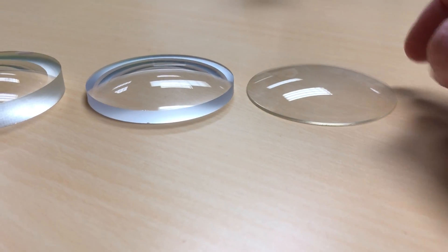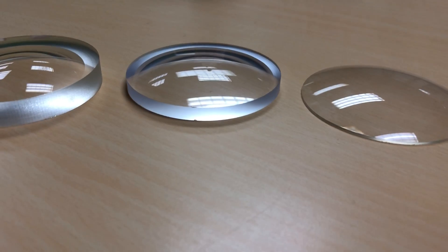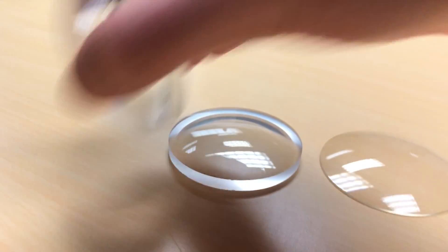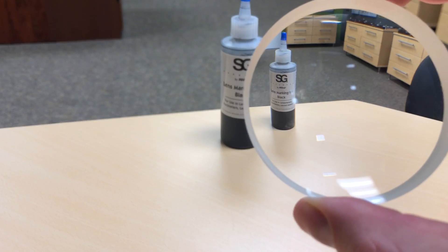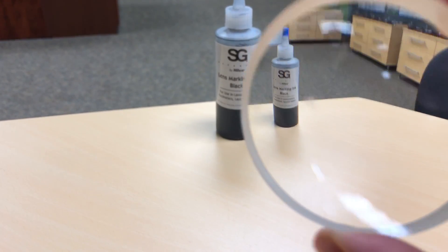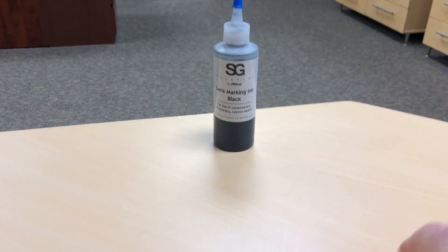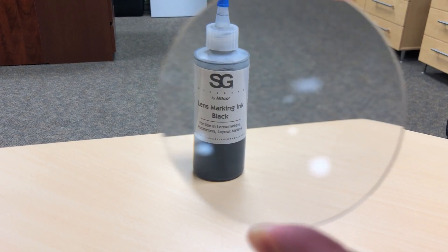So let's see what some objects look like through these lenses, so you get an idea of what happens to your sight and your perception while you look through them. Looking at that ink bottle through the minus six, you can see that it makes things smaller - my camera lens can focus it, but it makes things a lot smaller. Minus three still makes it smaller, but not quite as prominent. The plus three makes it bigger.